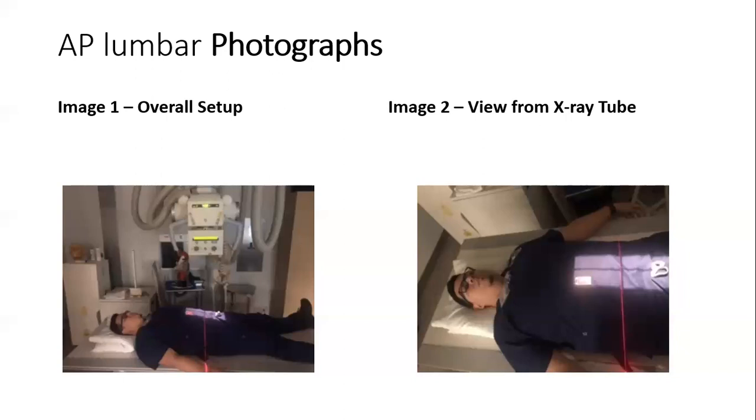The patient was laying supine on the examination table. 40 inches above the patient while lying supine on the examination table is where I placed the CR. I aimed the CR parallel with his iliac crest along with the pubic symphysis. There was no angulation of the CR for this examination.